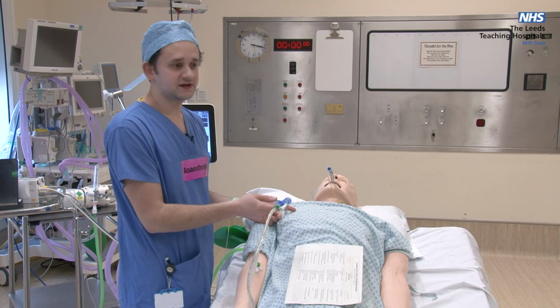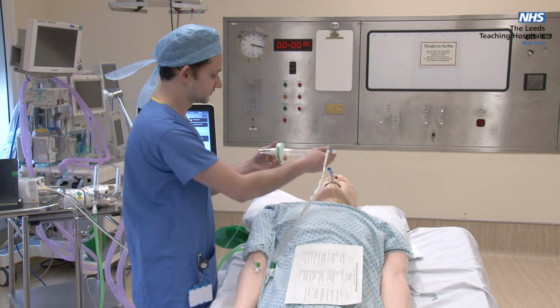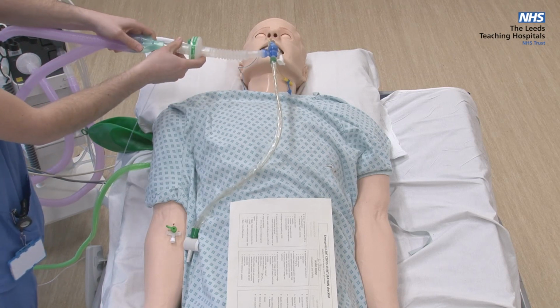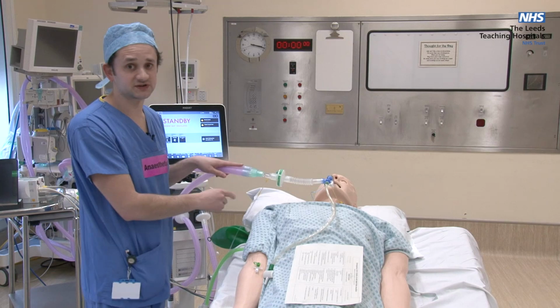Once the cuff has been inflated, and it's clear that it's been inflated, this can then be attached onto the airway, and the ventilator can then be attached onto the capnography. On the instruction of the intubator, the ventilator will then be started.